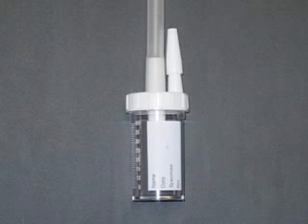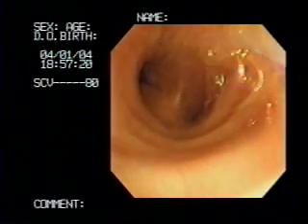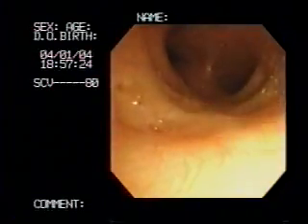A suction trap can be used to collect saline, which is irrigated into the airway passages. The saline is suctioned and removed from the airway passages by the bronchoscope and transferred into the trap. The carina and trachea are first irrigated.